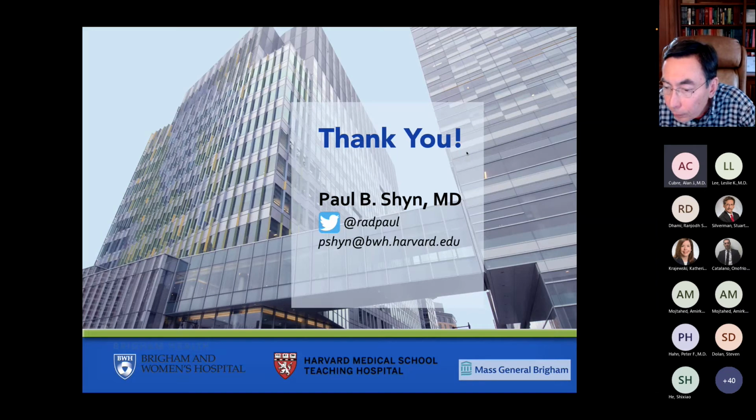Hey, Paul, I have a question. I know you didn't touch on this, but in patients that undergo treatment for HCC, LI-RADS has a pretty specific algorithm, but what I often struggle with is the signal characteristics we see around the ablation zones. Looking at the ablation images and thinking there's probably an adequate margin of coverage, meaning the ablation zone extends beyond, but differentiating that periablational zone signal versus how do you know it's not tumor? I'm trying to get away from the LR-TR equivocal because I'm not exactly sure what that signal is doing.